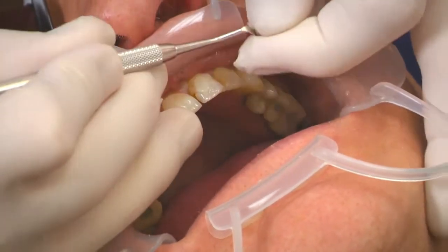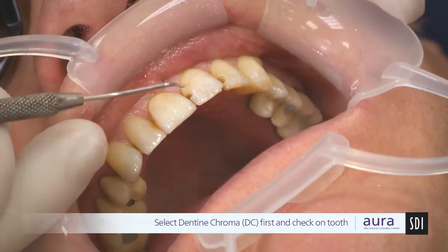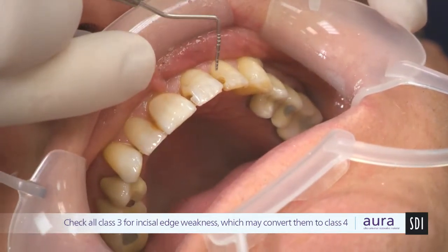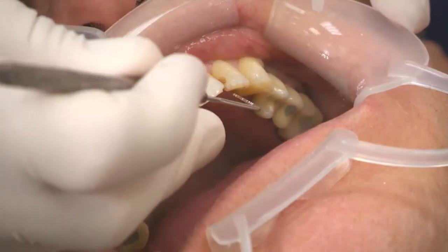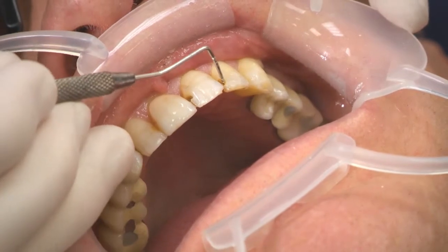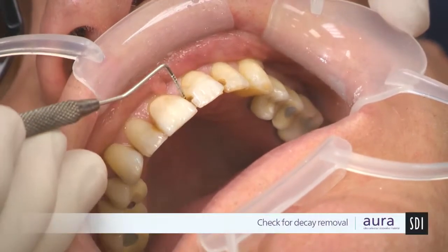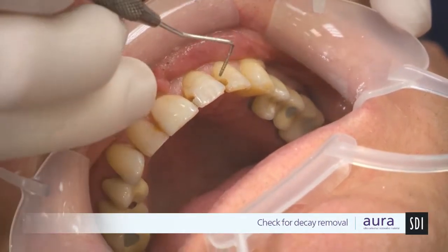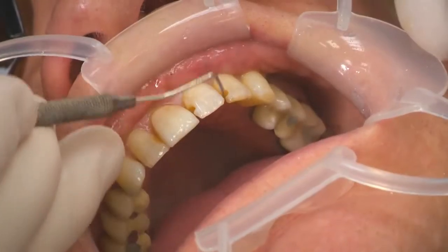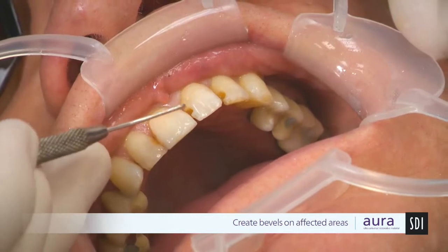We now have the situation of a through-and-through Class 3 plus a small labial Class 5. The distal Class 3, with the removal of the fractured zone, is becoming a Class 4. Also on the upper left 2, there is a large Class 3. We've got some staining in these areas, so we're going to use decay checker to ensure all decay has been removed. With decay checking done and long bevels created, we're ready to start rebuilding the teeth.